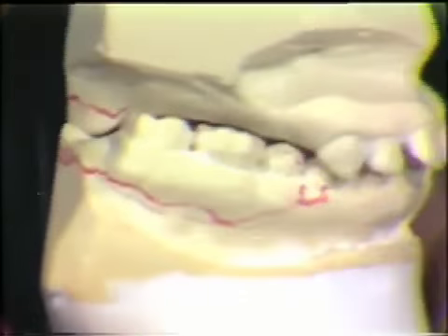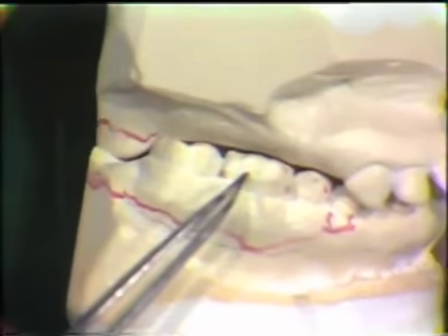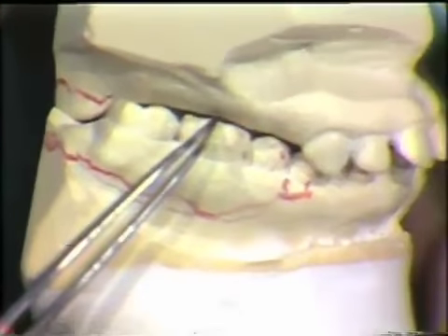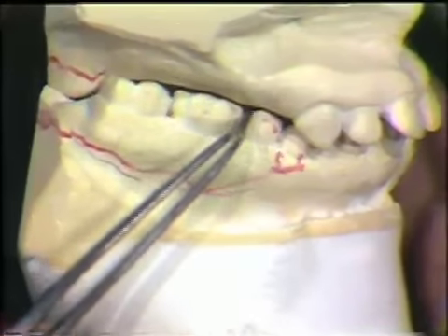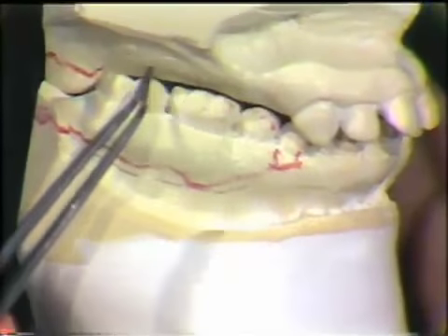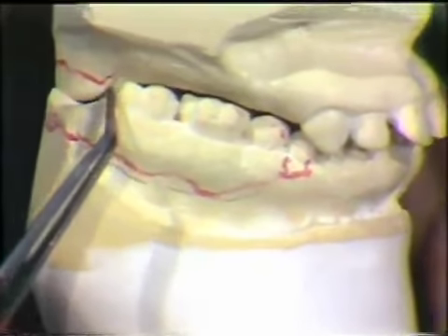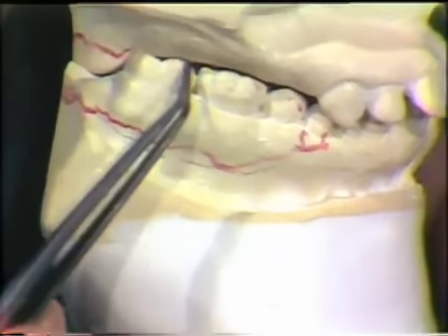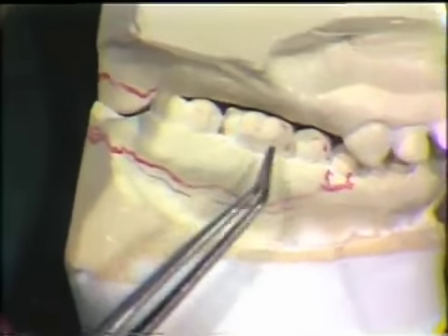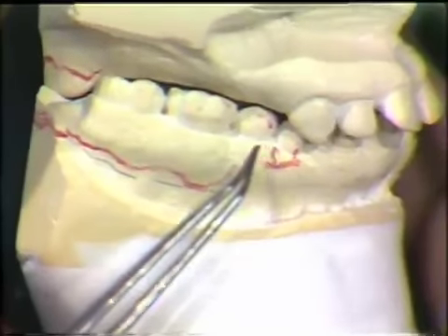We can see with these mounted casts, the lower dentition has erupted to start to touch the maxillary edentulous area. So when the maxillary teeth were lost, these lower teeth, because they were unopposed, continued to drift until they reached the opposing ridge. Now, from the standpoint of reconstruction, this poses an extremely difficult situation.